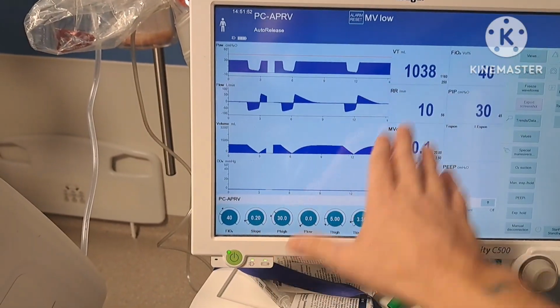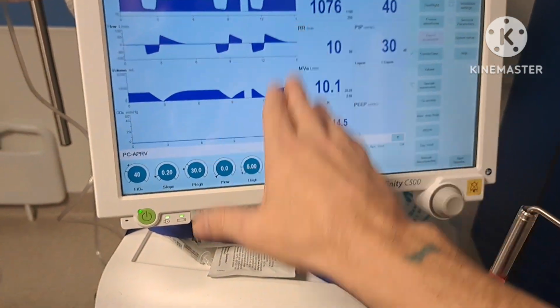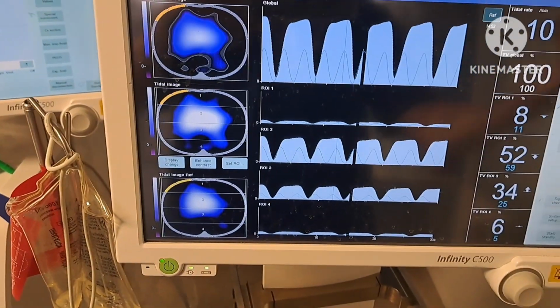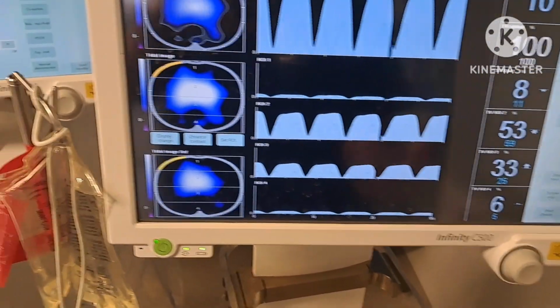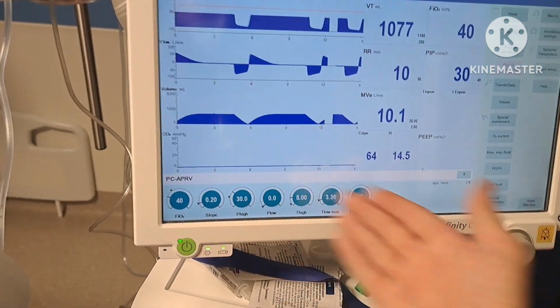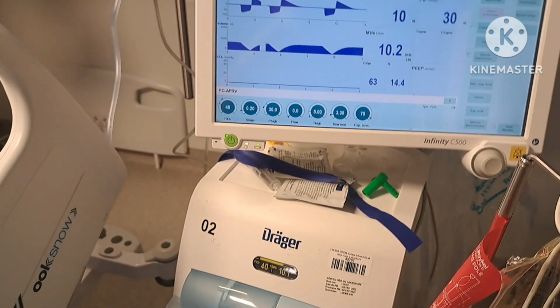We're tolerating pressures. We're looking at opening up the lung, and then after we will find the P high with the best compliance. From there, lung recruitment could occur, and that P high may not necessarily be required to be that high, and then we can wean down. And like usual, the P high, just like your pressure support or anything else, as the lung improves, it needs less pressure, the tidal volumes will go up, so that's how you know to wean your P high. So it's like any other mode of weaning.